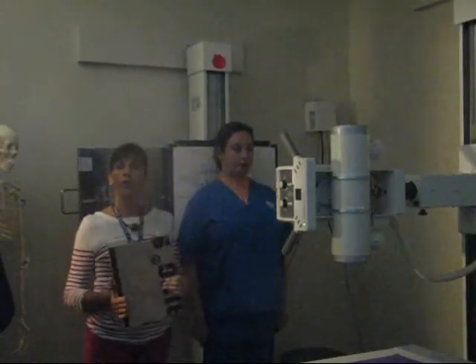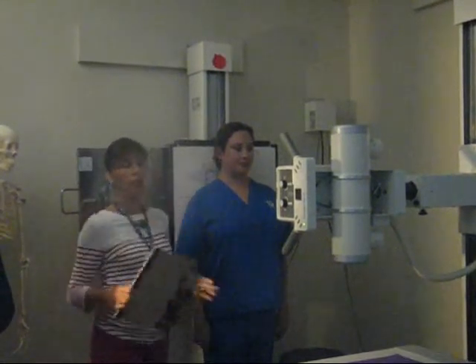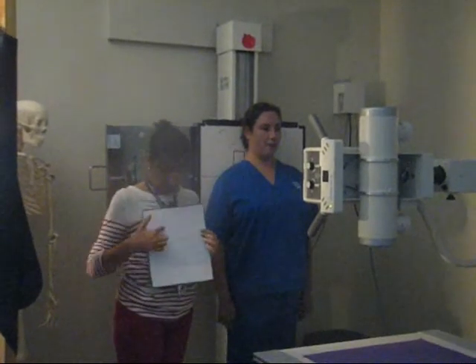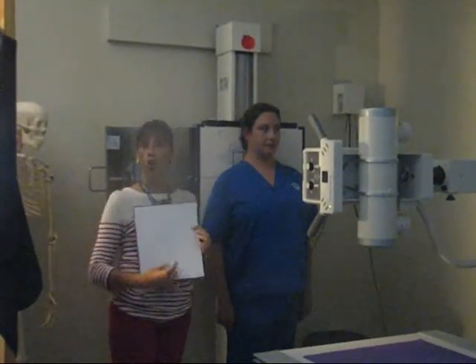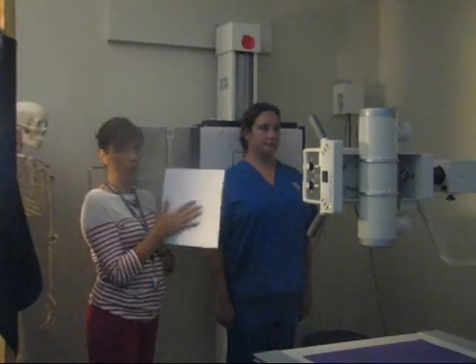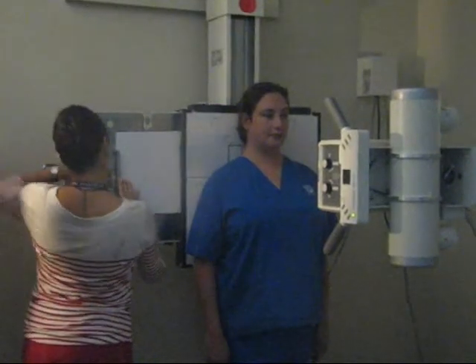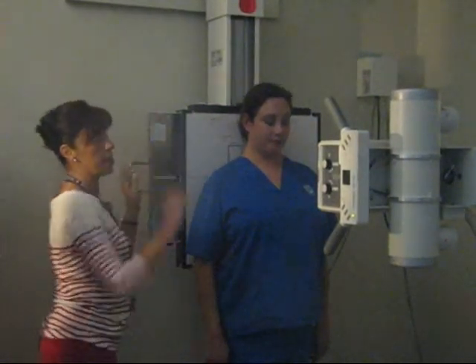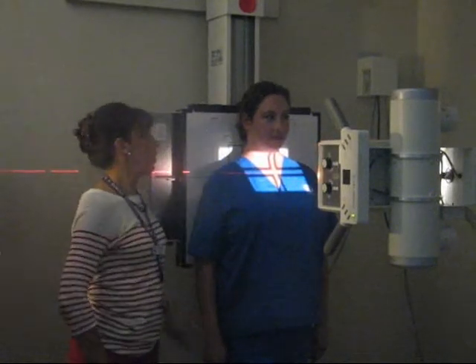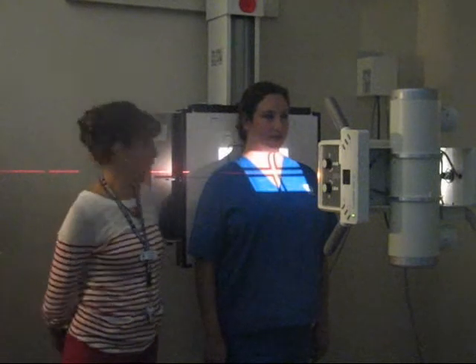We're moving on to the scapula. As you know, the scapula is that wing bone that people have back there. If you remember, the shape of your scapula is kind of long in direction, per se. So you're going to use 10 by 12 lengthwise. Okay? It's still done at 40 inches SID. And we have two main positions, or two main projections.